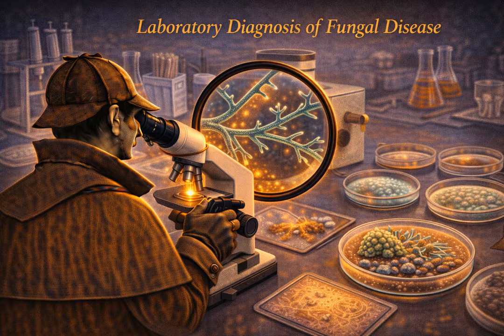High contrast really seems to be the theme here for finding them. Maximum contrast. Even if the fungus is dead or dying from prior antifungal therapy, the silver will still stain the residual wall. This is the absolute best stain for seeing the morphology in tissue. Is it branching at 45 degrees? Is it septate? GMS gives you the sharp silhouette you need to answer those structural questions.